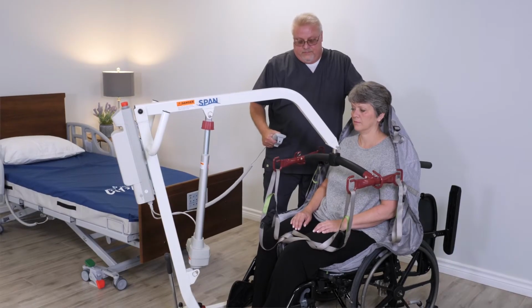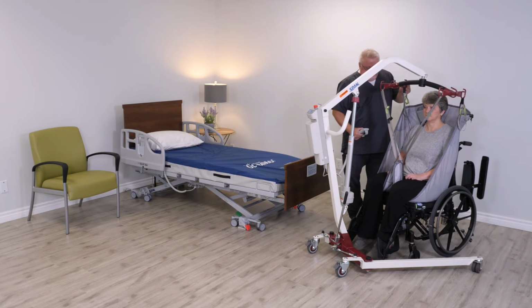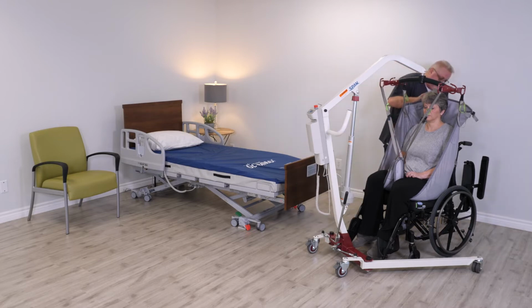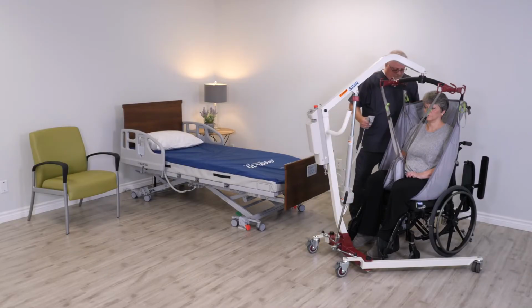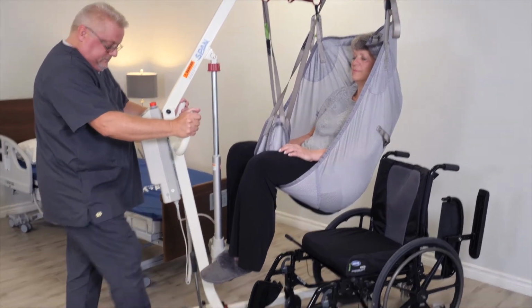Use the hand pendant to begin lifting the patient up out of the chair until the slack has been eliminated, pausing long enough to confirm that the straps are not twisted, the sling is not caught on the chair, and the patient is securely and properly positioned before resuming. Resume lifting until safely clear of the chair seat.